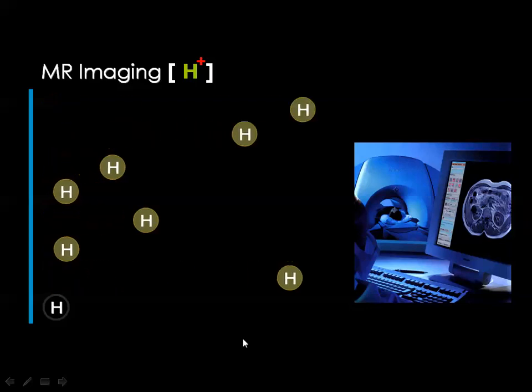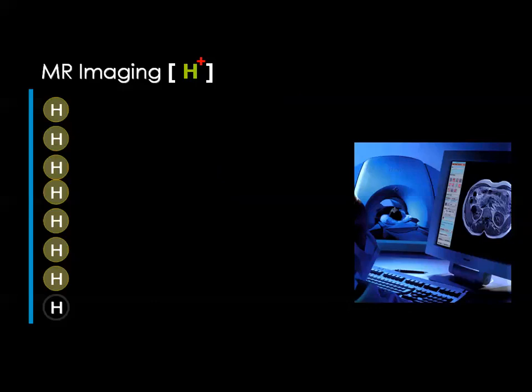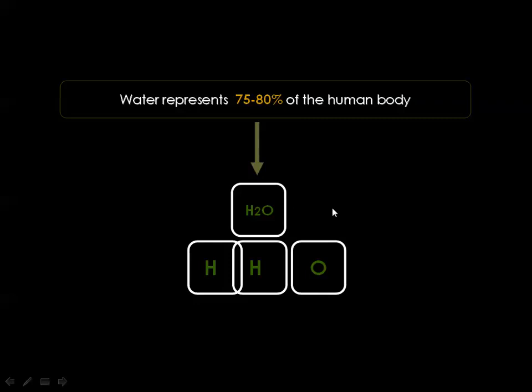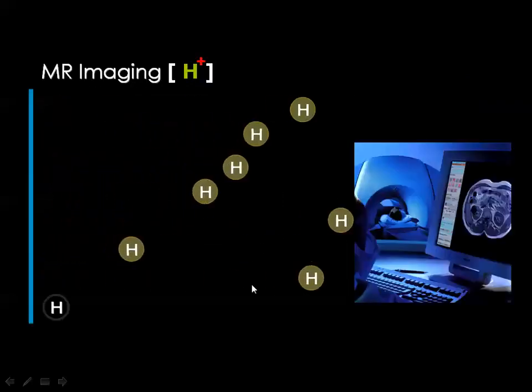And this is also known as resonance. Either you get sound or you get motion. Then if you look carefully now, you will see that the hydrogen is not moving at the same velocity. You see some hydrogen is moving fast, while other hydrogen is moving very slow. Also you notice that some of the hydrogen atoms do not move at all.